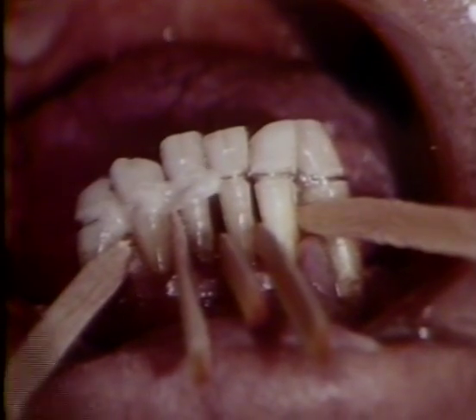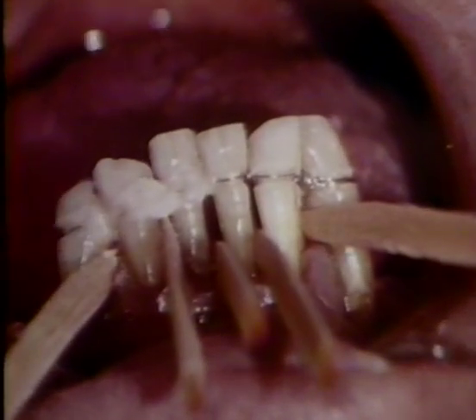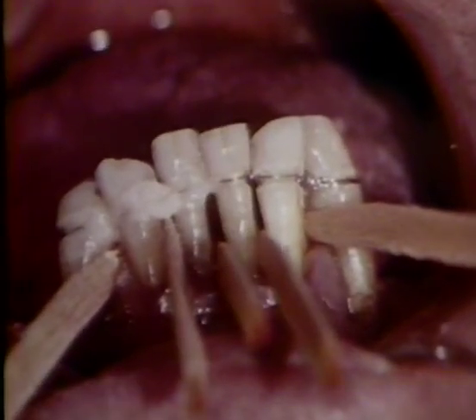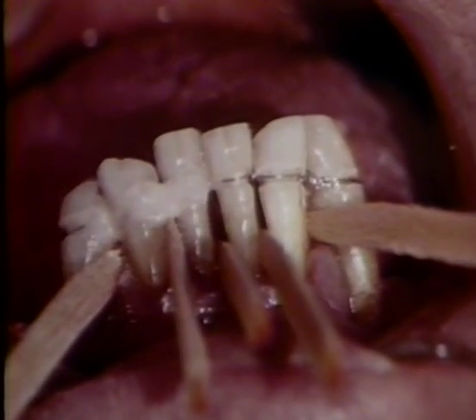The stabilized teeth will permit periodontal therapy to be carried out on the canines and lateral incisors. These teeth can then be permanently immobilized and a mandibular removable partial denture fabricated.